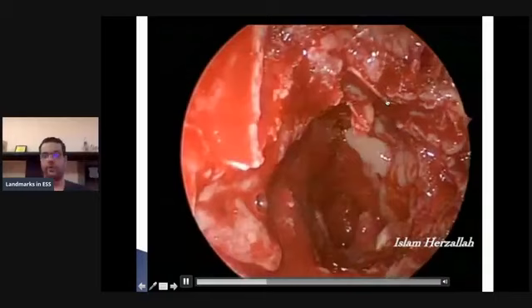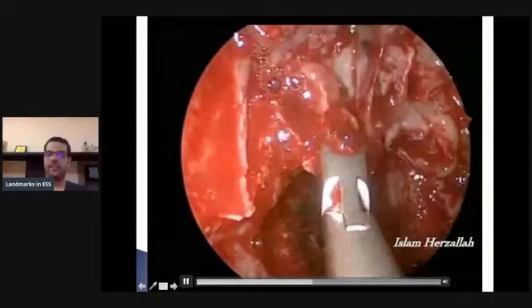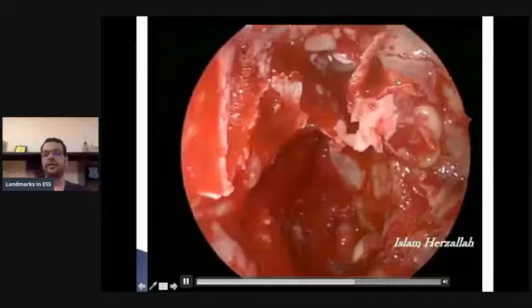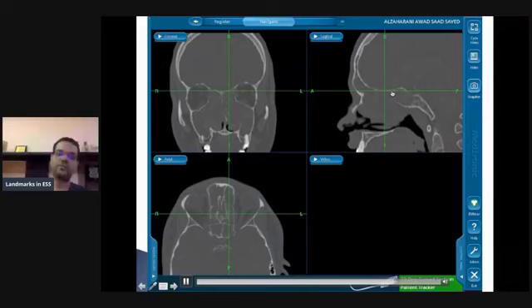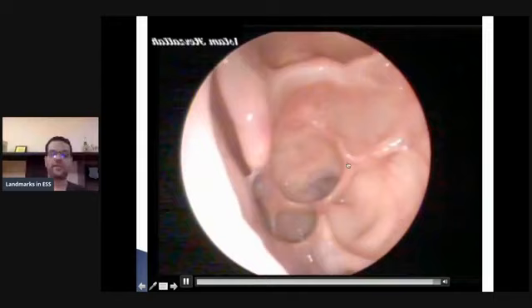Right here, I'm taking it down cell by cell over the skull base: the skull base of the posterior ethmoid, then the skull base of the anterior ethmoid, and the cells on the lamina papyracea as well. I'm taking them carefully from posterior to anterior in order to clear all the disease of the patient. From the sphenoid through the posterior ethmoid, the navigation shows exactly where you are going, all the way to the frontal recess lesion. Postoperatively, you see the remaining part of the superior turbinate, and all the cells over the skull base are clear.